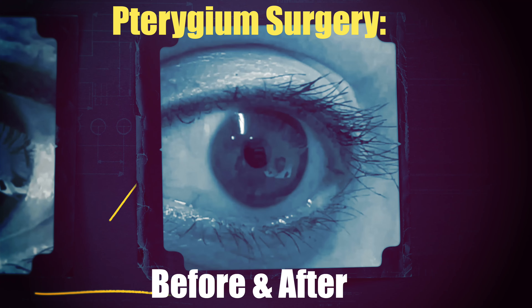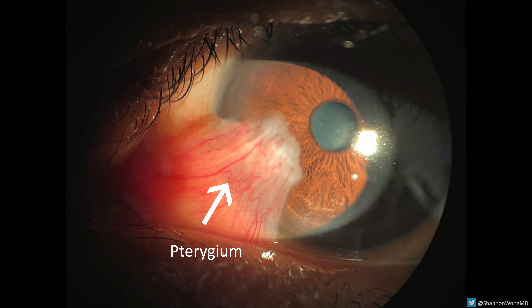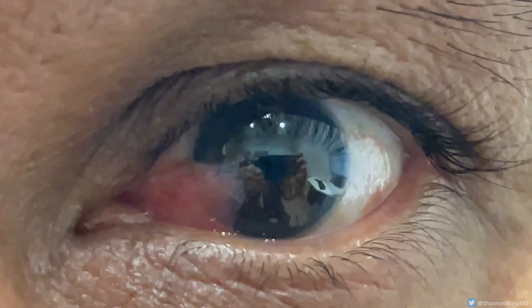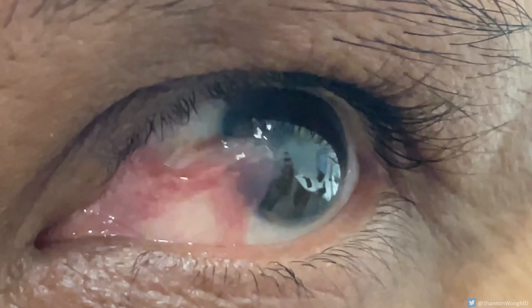Pterygium surgery before and after. This is a pterygium. In this video we'll show how we remove it and then show the appearance of the eye one day, one week, and three months after surgical removal.